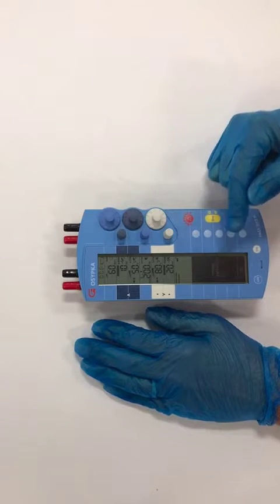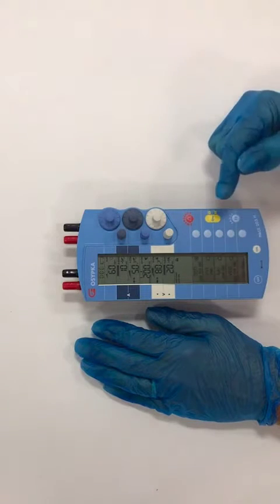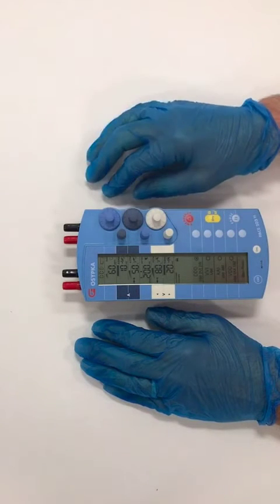To stop the alarm, you press the OK button or the yellow button — it doesn't matter — and we're now going to change the battery.